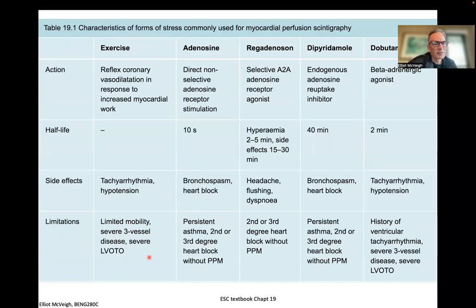But this is a great method of generating stress for the heart. They even have bikes that you can put in a scanner in a recumbent position. I mean, you've seen these crazy guys on recumbent bikes riding down the road, right? Well, you can put that same kind of geometry together for a scanner, and then the patient pedals while they're in the scanner, and then you stop pedaling and take an image. The problem with that is, with this type of stress, the patient really starts breathing hard, right? There's no way you're getting around that. They've got to breathe. So you say, hold your breath for 30 seconds. That's not going to happen.